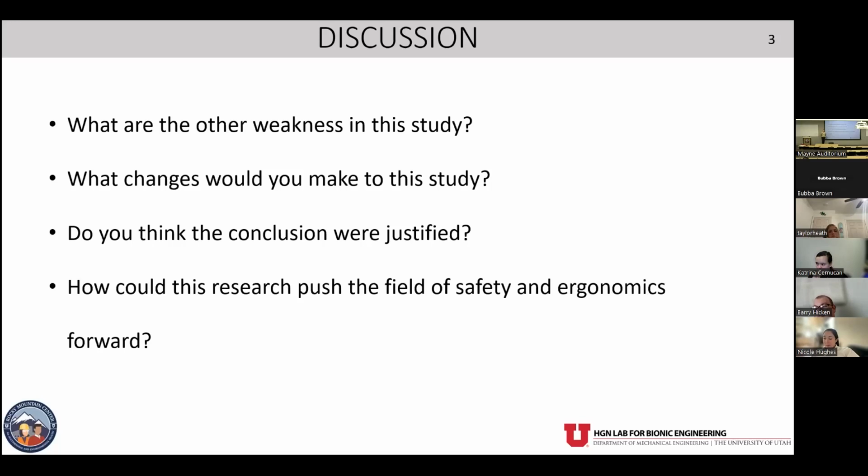Yes, that depends a little bit on the muscle, because every muscle's shape is different and when its activation is different. Also, what looks like high activation for me is going to look like a different high activation for somebody else. So you really need to look at those signals as they compare to that individual in those movements. You can't really compare A to B. Ideally, once you've got the surface EMG electrodes on, you don't want to move them. You absolutely do not want to move them at all.